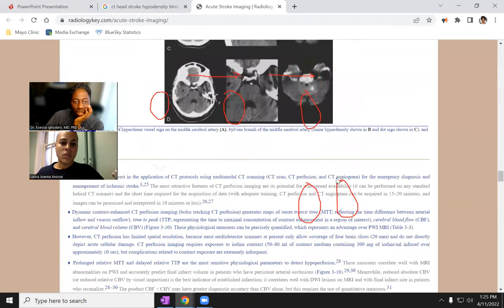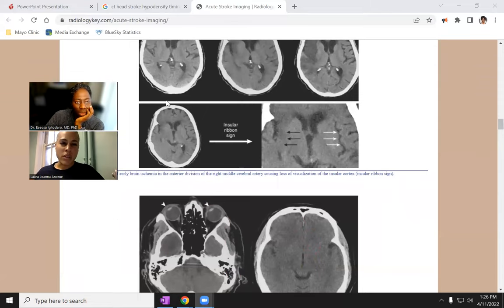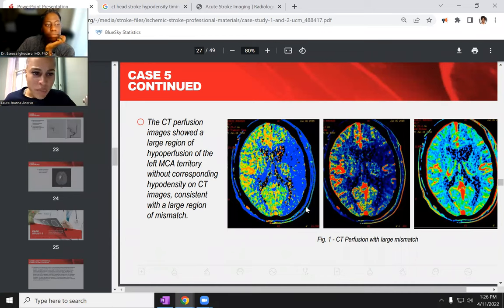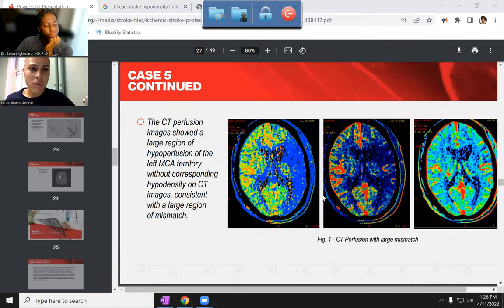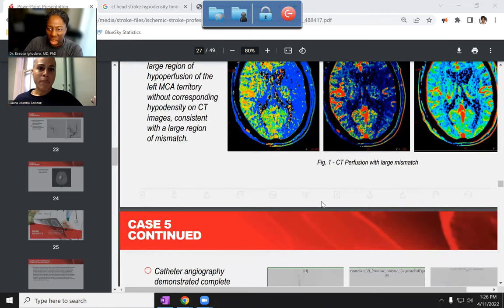I'm trying to see if there's anything else helpful on here. Nope, that's it. Makes sense? Yeah. So in this particular case, the hypodensity would be the definition of this acute, we've defined it as an ischemic stroke, then this would be equivalent to that ischemia that's cytotoxic. Yes. Cell death. Okay, yep. Fair enough. Awesome, great question.